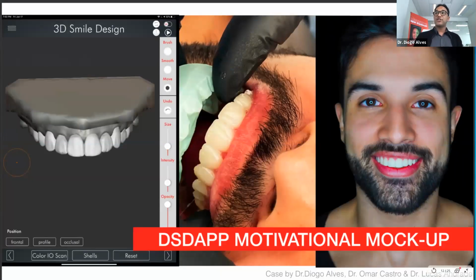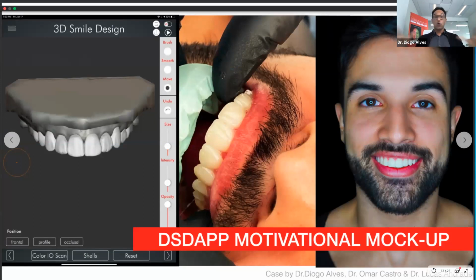Some of our patients, they are sold already from the first moment you show them the smile simulation. You show them smile simulation, you talk to them, and they're like, yes, let's do it. But other patients, they are a little resistant. They want to do it, but they are not 100% sure. So what can you do? You can create the motivational mock-up.